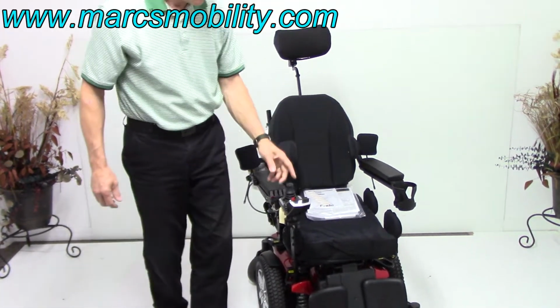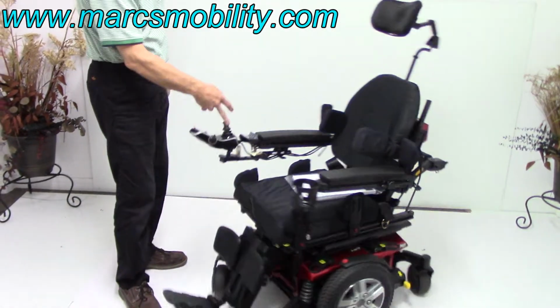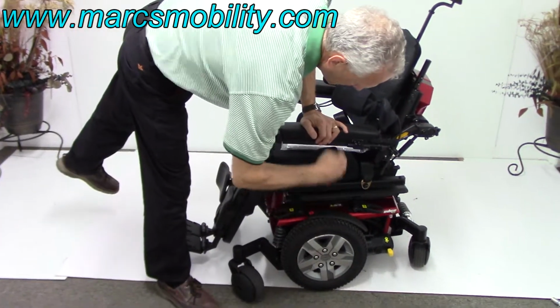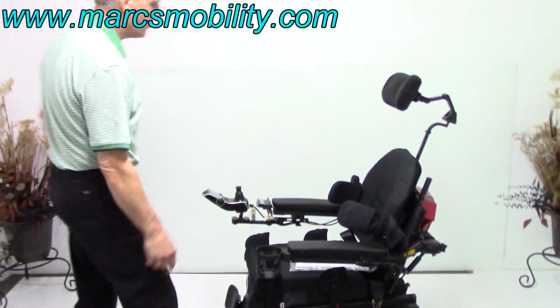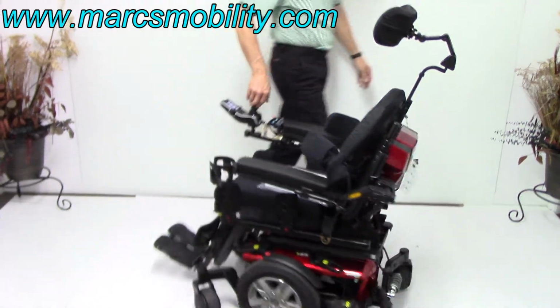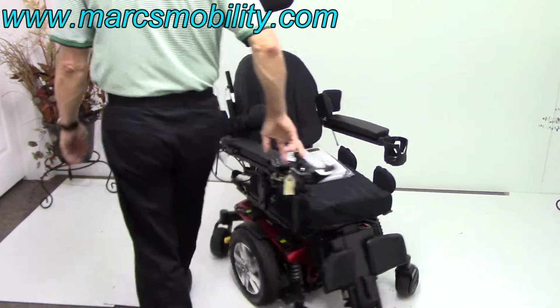So now the turning radius on this chair, this is a mid-wheel drive. What that means is the motors are in the middle. That's your mid-wheel center point is right here. This chair will turn all day long on its own length. So I could do this all day long if I wanted without moving in the same spot.